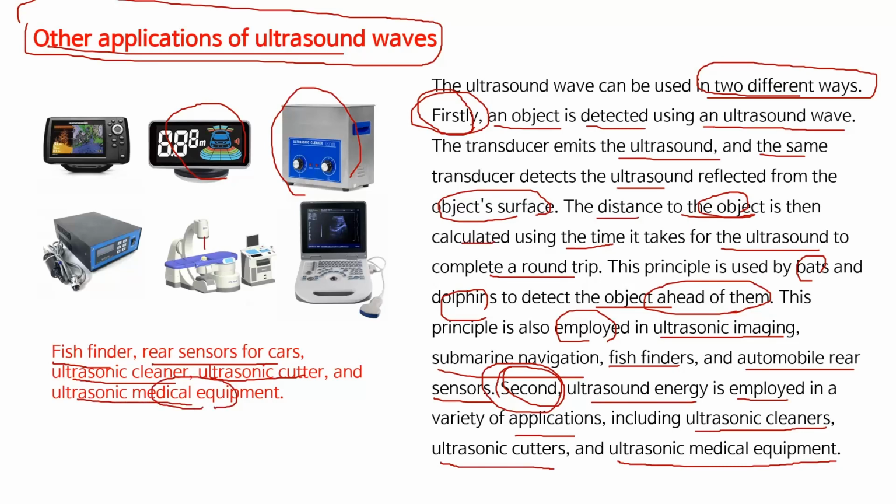If we use this equipment, we can destroy or scatter the stones in the kidney, and the scattered small stones can go out of the body via the urine.